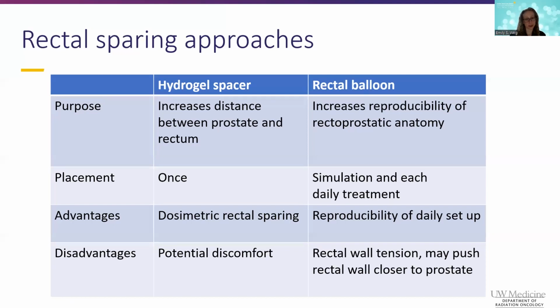The potential disadvantages with the rectal balloon are that we increase tension on the rectal wall, and we may actually be pushing the rectal wall closer to the prostate. So these are both reasonable approaches. Our center now uses a hydrogel spacer and no longer uses a rectal balloon.